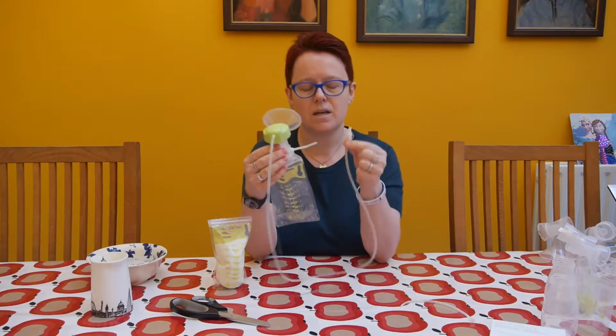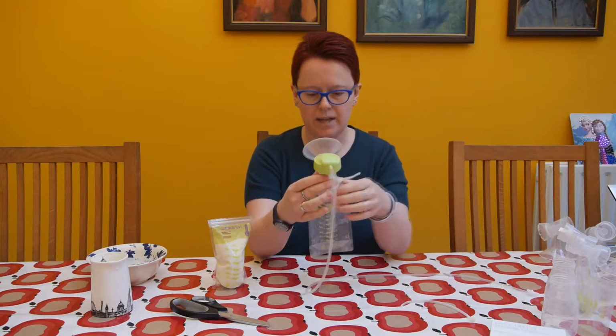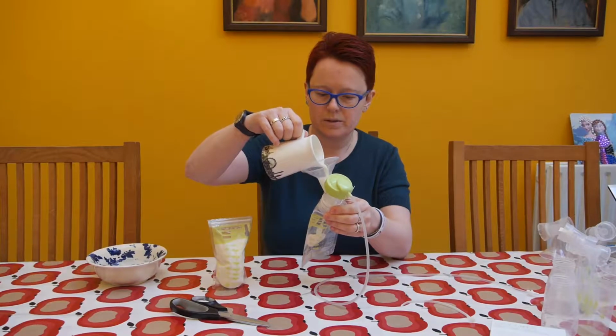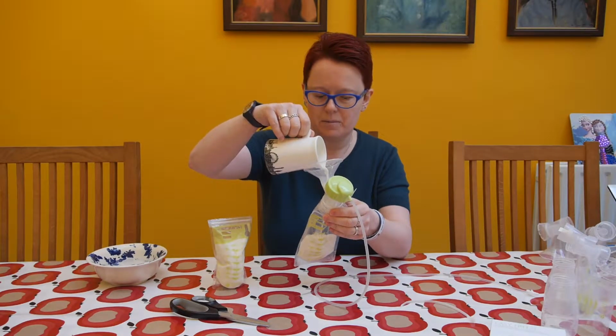And then this is the end that's going to go into the back of our pump to get the pumping started. Okay, so let's imagine we've done some pumping. I'm just going to pop a little bit of milk in there. Doesn't fill the bag quite this quickly when you're pumping in real life.